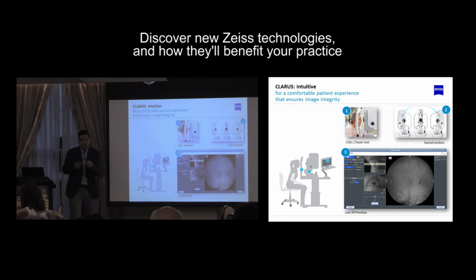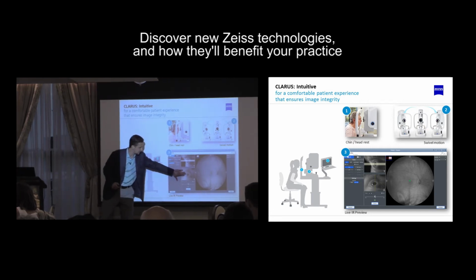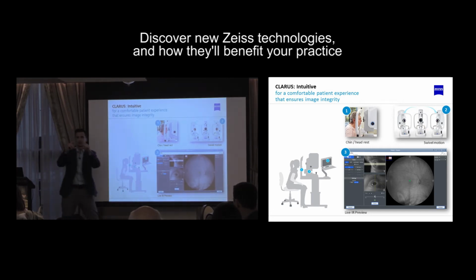But what they did to draw the image in was they paid attention to what was happening in the centration on the pupil, and aligning those two pieces got it right into where they needed to take the correct image. And then when the fixation target switched, they switched that over.